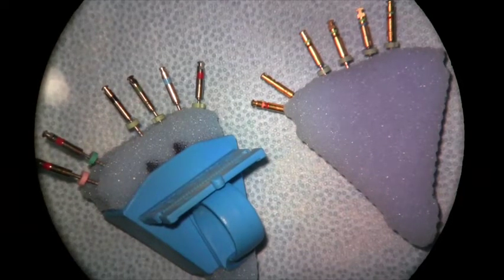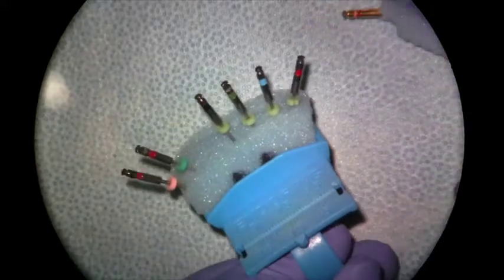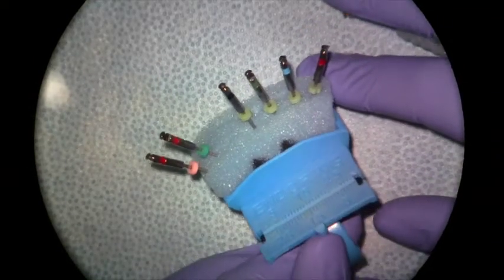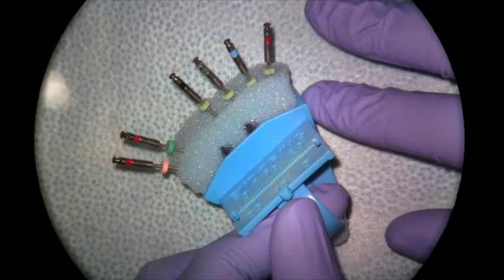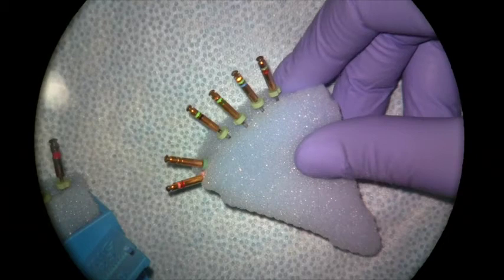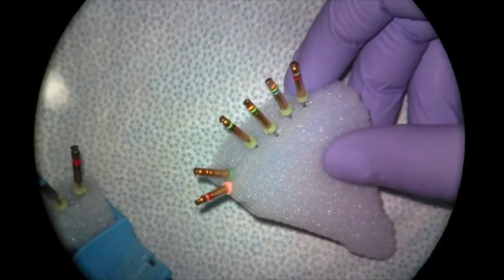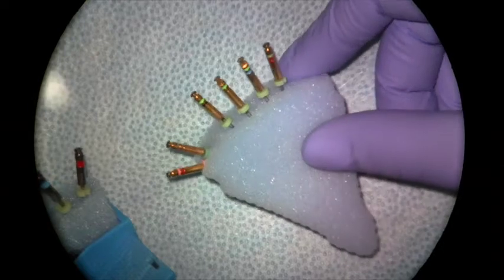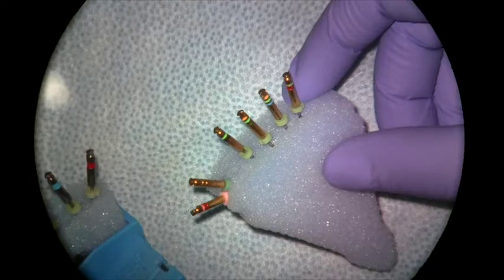Before we go over your rotary instrumentation technique, I want to go over a little bit about the files you'll be using in pre-clinic and in the clinic. In your lecture notes and in the clinic we'll be using the K3XF file system, but in the pre-clinic we're going to be using the K3 system. They're the same exact file as far as file design and the technique that you use them with — it's just that the metallurgy in the file is a little bit different.